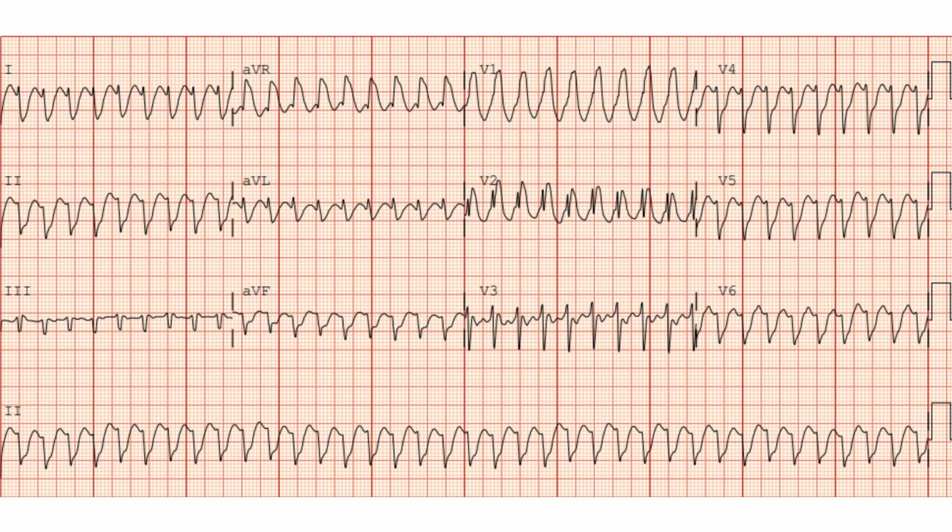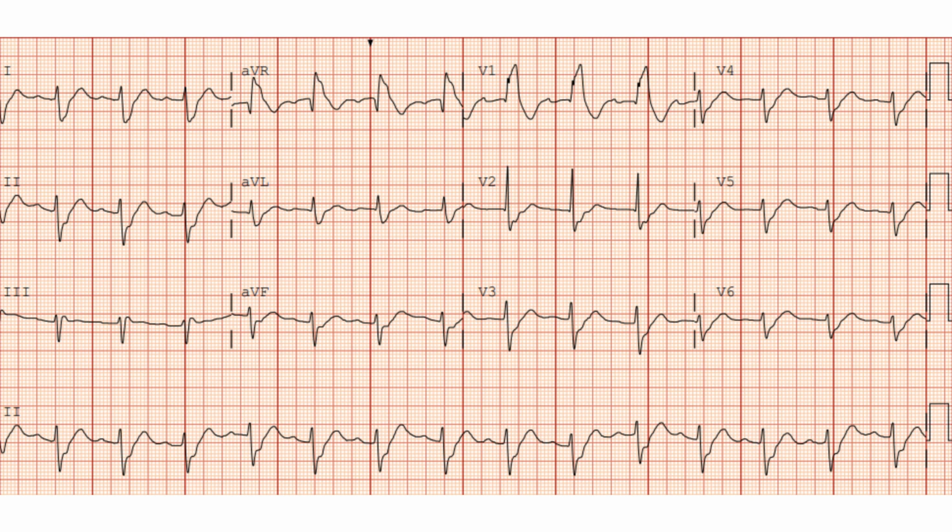So the only other option you have is, well, number one, obviously we consulted cardiology, right? Number 2, we chose procainamide, and we'll get into that later. He did very well on the procainamide. About halfway through his bolus, he converted back into normal sinus rhythm. And this is his EKG after he converted.